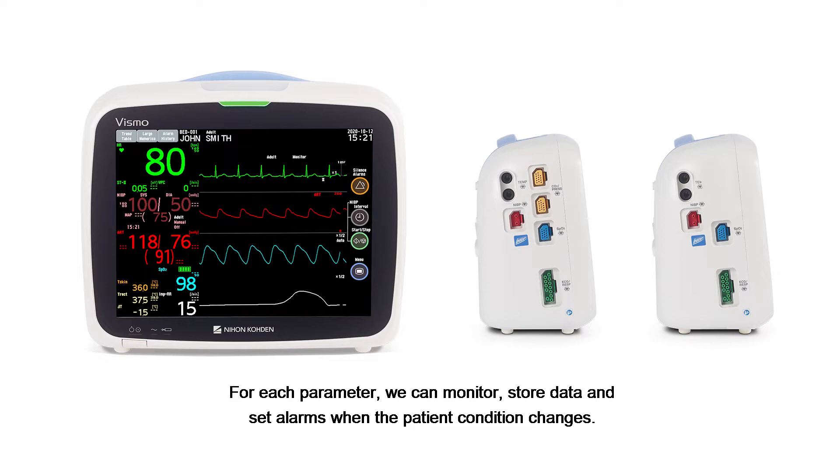For each parameter, we can monitor, store data, and set alarms when the patient condition changes.